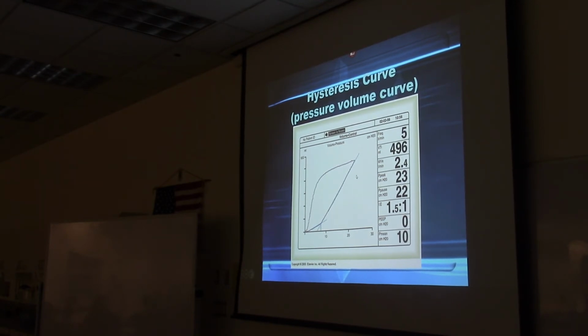All right, so looking at this, can you tell what the peak pressure is? So you look at the point, the furthest point over, and then you look down. And that tells you what the pressure is? It's over 20, right? Maybe like 22 or something? 23. What's the axis?